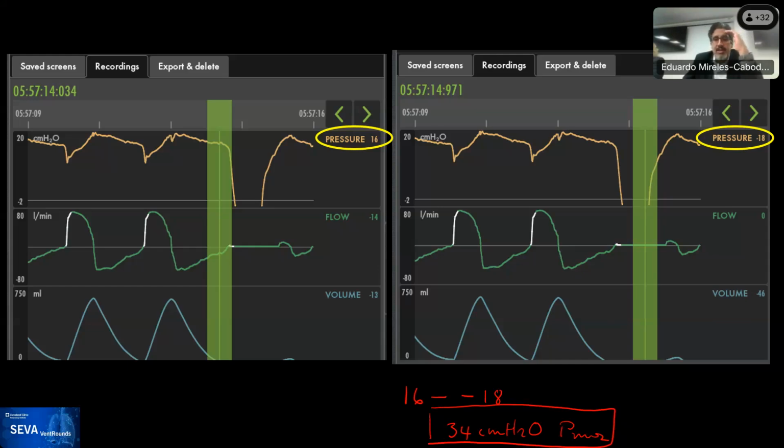I also want to address a question that came out, and this is an go ahead, Adi. Yeah, you know, all the information you're talking about is available in the ventilator. The ventilator knows the compliance, the volume, and the pressure it's supposed to give. So it knows the work that it's supposed to do. And if it doesn't do that amount of work, the rest is what the patient did. So I don't know why the ventilator is not giving it to us. It's an engineering issue. The data are there.